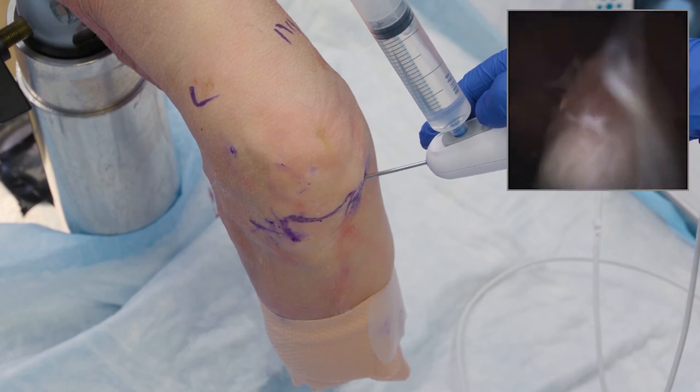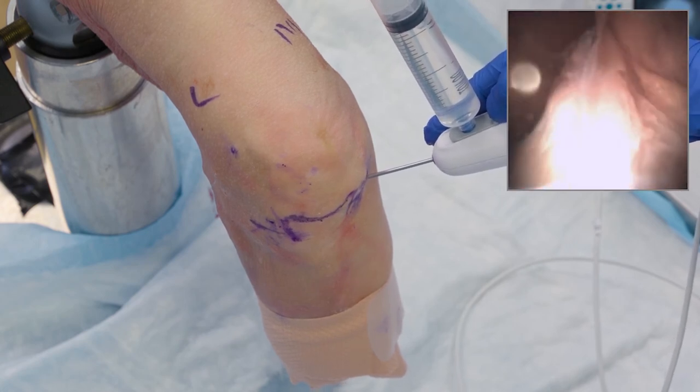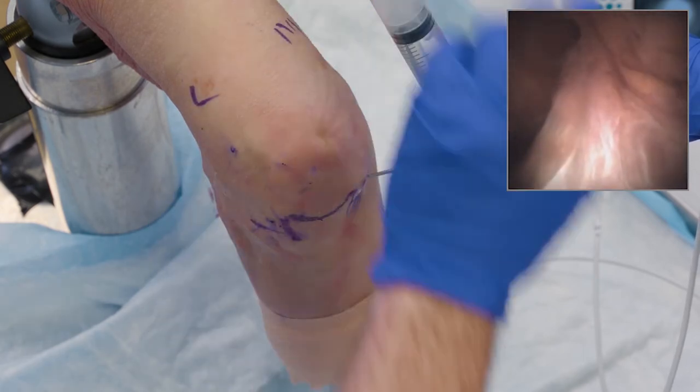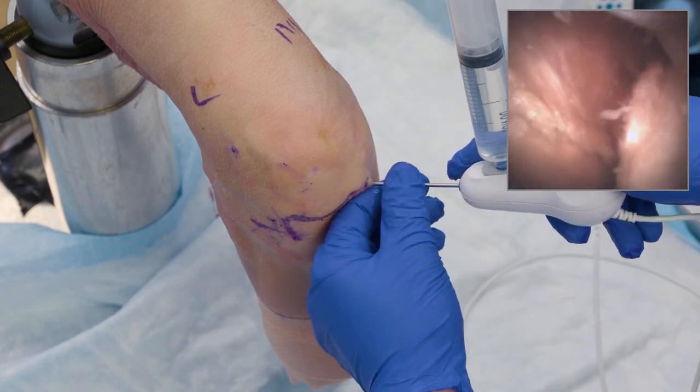The key in the beginning is to avoid putting too much fluid into the knee joint. But if you have to cheat a little, go suprapatellar and look to find a way into the medial or lateral portal without any soft tissue impediment. From there you can continue your diagnostic evaluation.